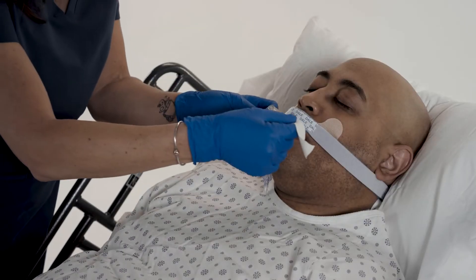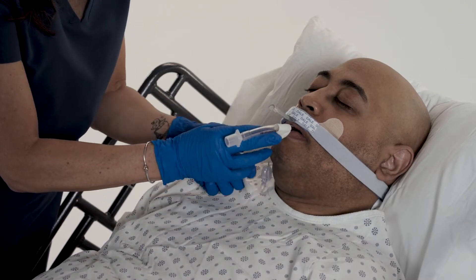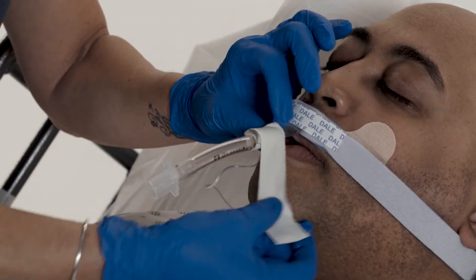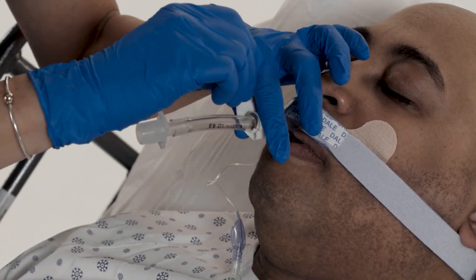With the tube resting below the channel, wrap strong adhesive tape one time around the ET tube. Press the tube channel onto the tube, then firmly wrap tape in a forward spiral motion around the channel and ET tube to secure.